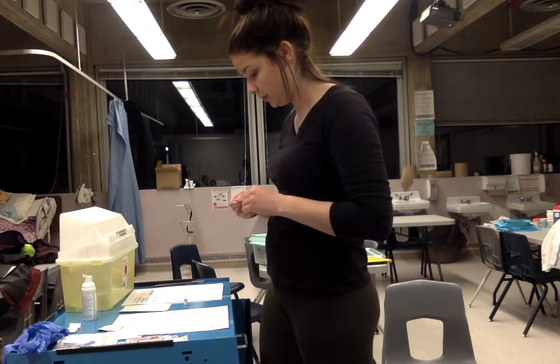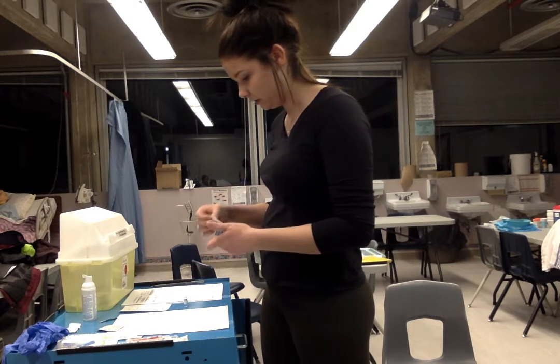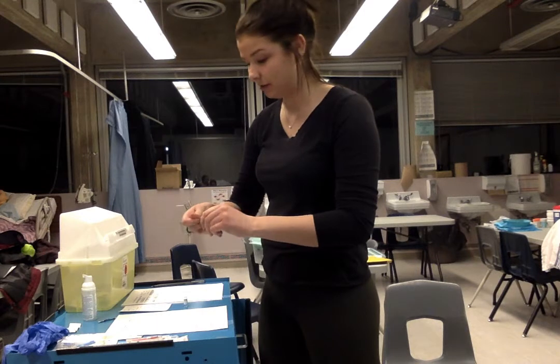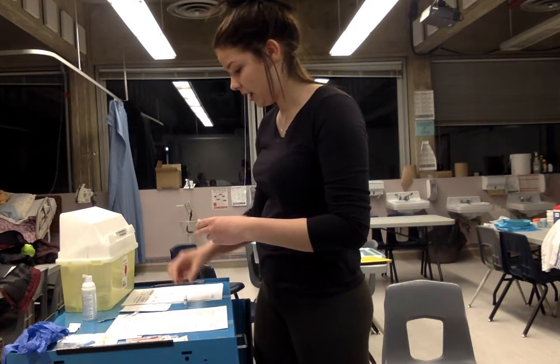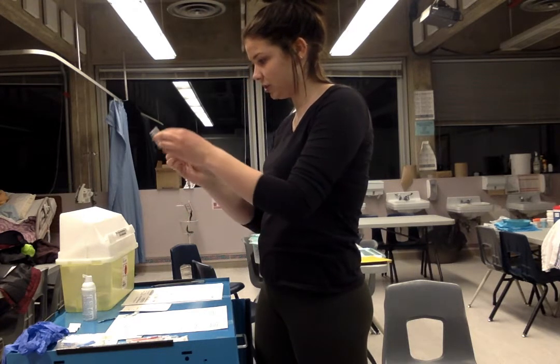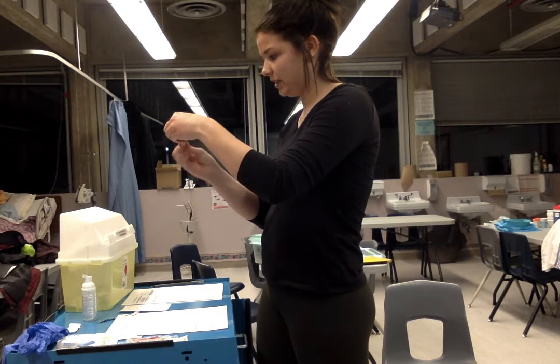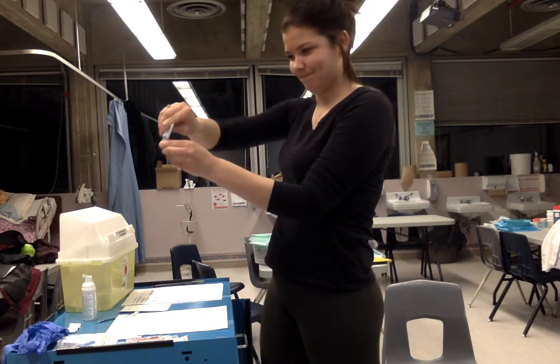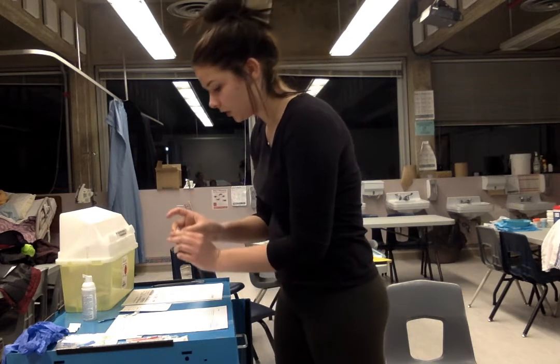All right, so now I need to give my ampule a clean and break it. Okay, I'm just going to try that again. I didn't want to pull that out. All right, here we go. So now we'll just open it and clean it. And we want to make sure that everything's out. So we'll give a nice clean and snap that right off. Straight into the sharps we go with that.